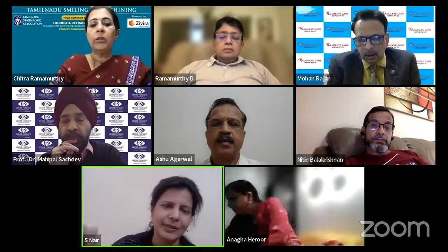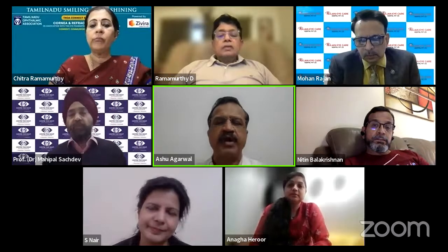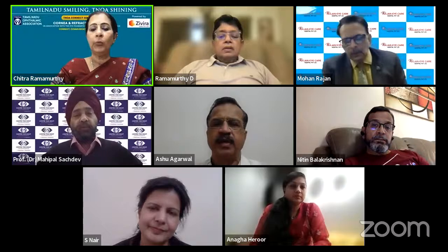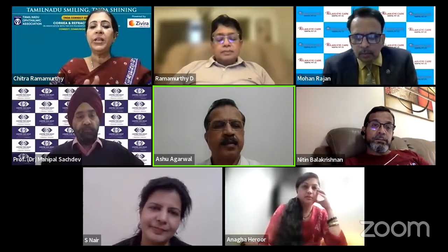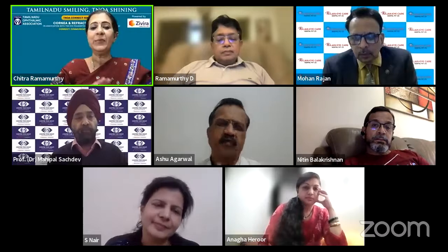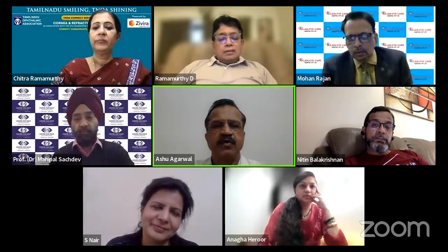I think what sir is saying is right. Squeeze it out with viscoelastic, do a visco expression, just squeeze out the bubble, and then create another opening, maybe with a sharp instrument, with a normal blade. Or worst case scenario, inject C3F8 gas. And of course, C3F8 will also do the work. Yeah, of course. That's the ultimate. That's what we usually do.